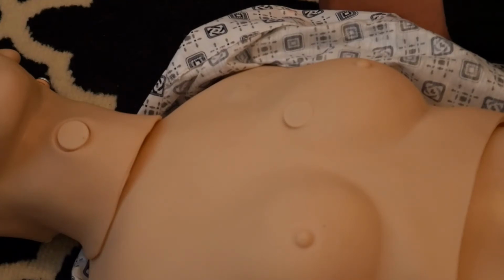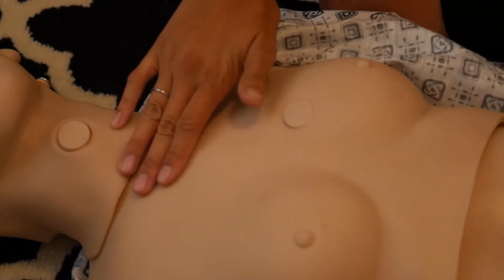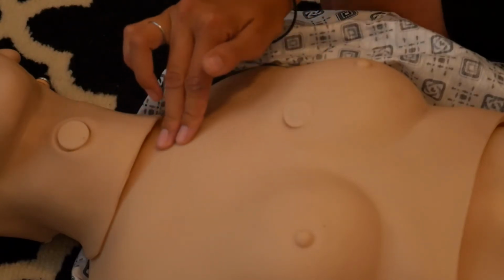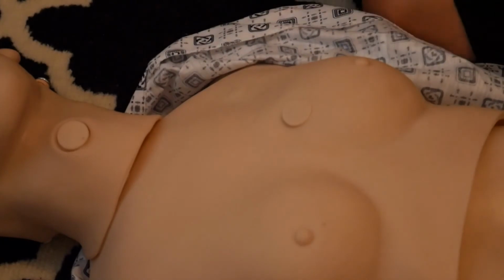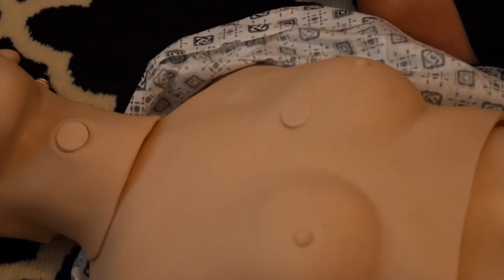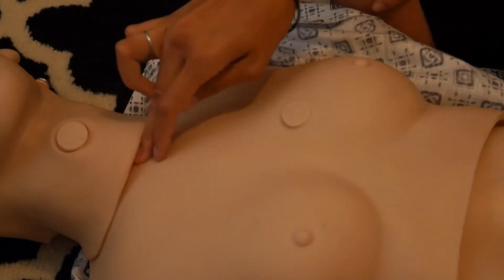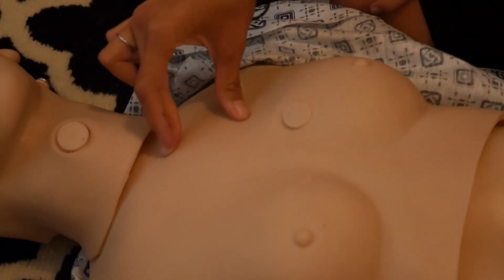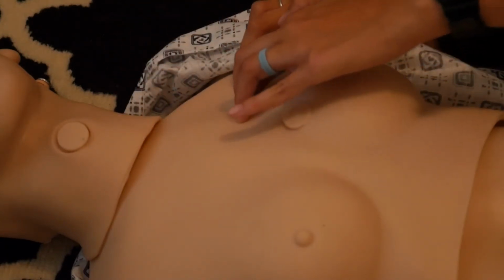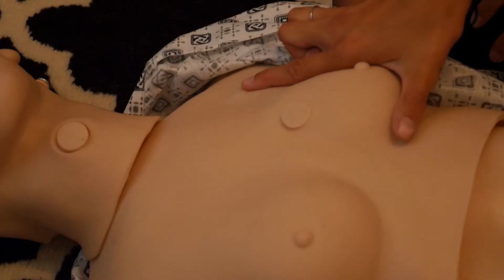Okay, so there's three sites. The first is the anterior site, which is just the front of the body, in between the ribs, lateral to the nipple, away from the middle. In medical terms, it's the anterior site. Second intercostal space, just right above the third rib. Mid-clavicular line, and it's going to be lateral, so away from the nipple, so about right there is perfect.